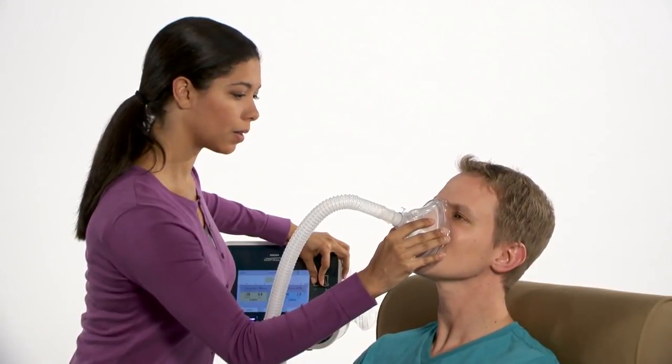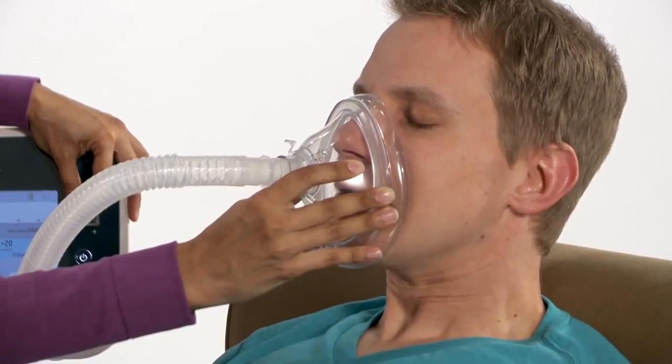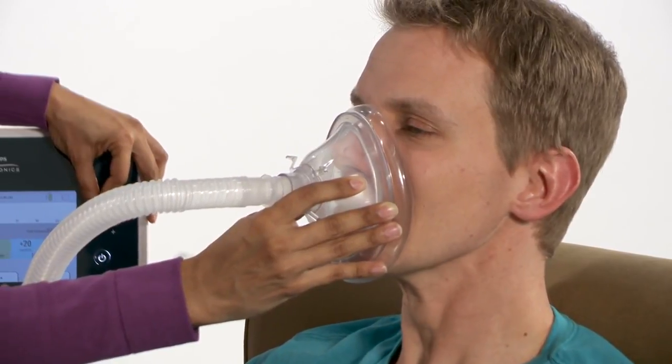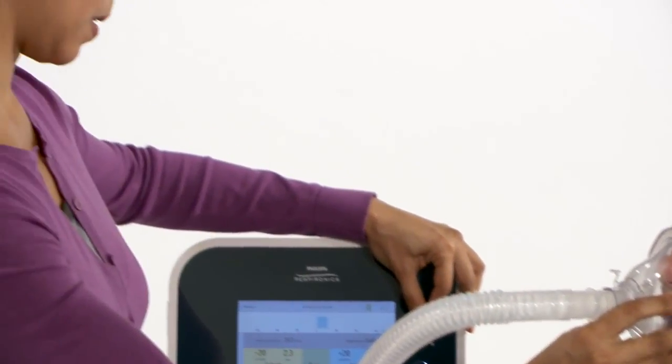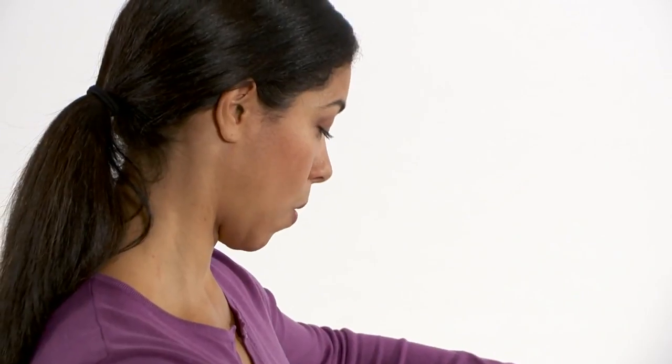For the initial treatment, you may want to begin with lower pressures to give the patient a chance to get comfortable. You can gradually increase pressure as described in the pressure and timing adjustment portion of this program.